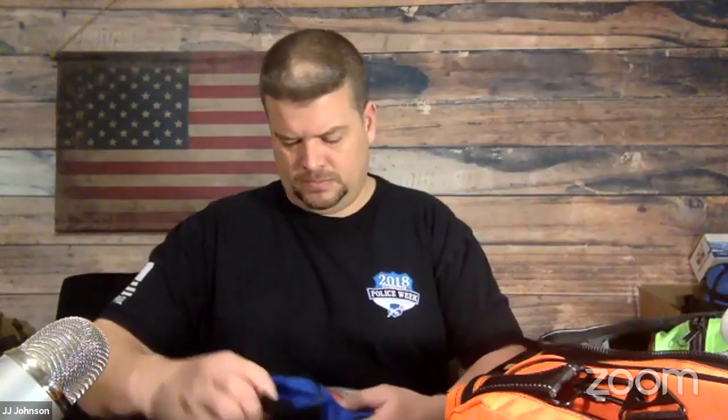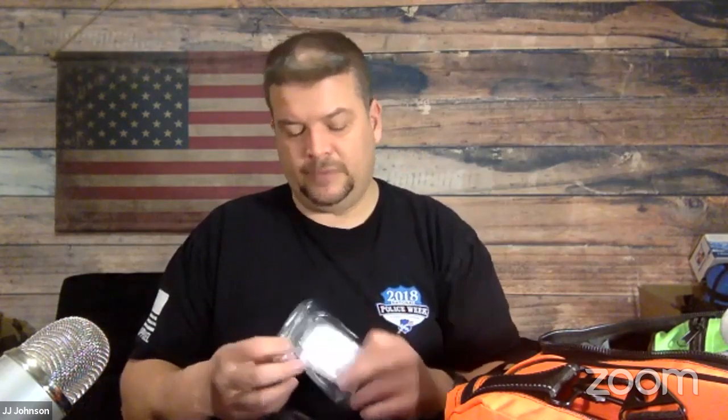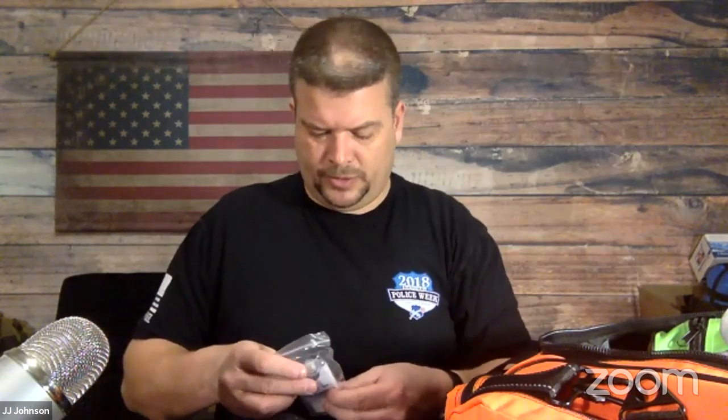Got that back there. Okay, so the blue one was airway stuff, because you turn blue, you know. And so, let's see what I got in here. So we've got some airways, different kinds, different colors, different widths, you know, all that kind of stuff. And I don't have an NPA in here. That's funny. So I have NPAs in my other blowout kits. I probably need to get some for in here. So it's good I'm doing this little inspection, because it makes sure I've got it right.